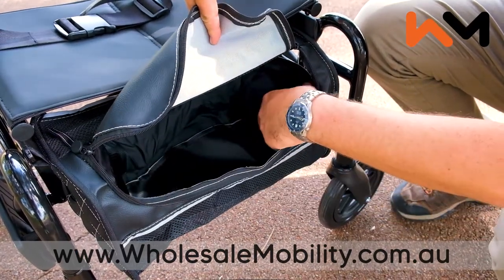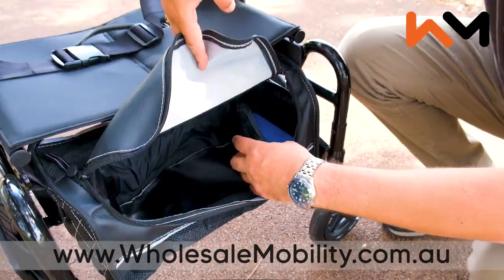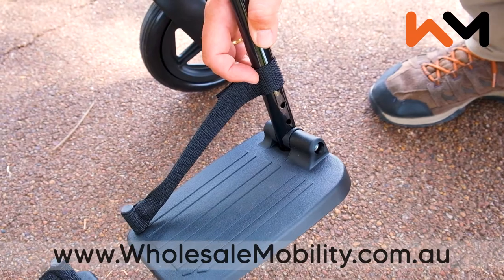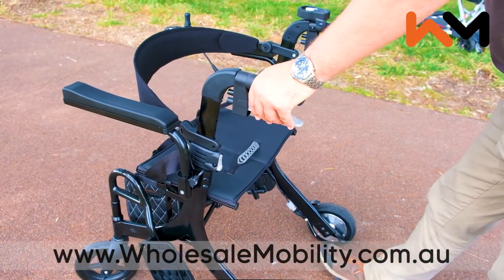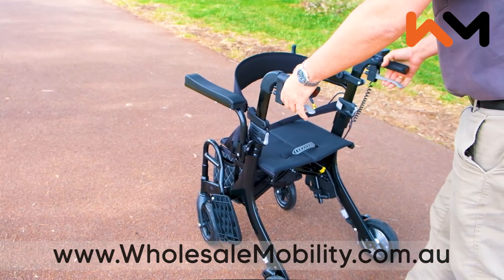The lithium battery is located in a pocket of the under seat storage bag, leaving plenty of room to carry other items securely. The foot plates are height adjustable for maximum comfort. Like all rollators, the Evo is fitted with manual lockable brakes for situations when the motor is turned off.